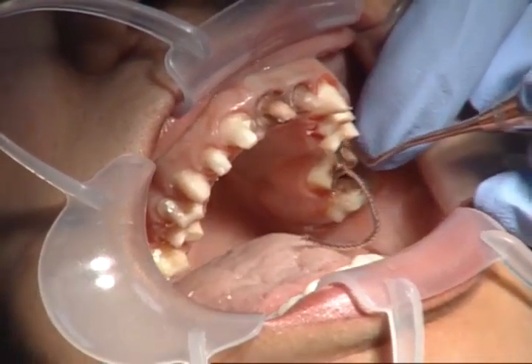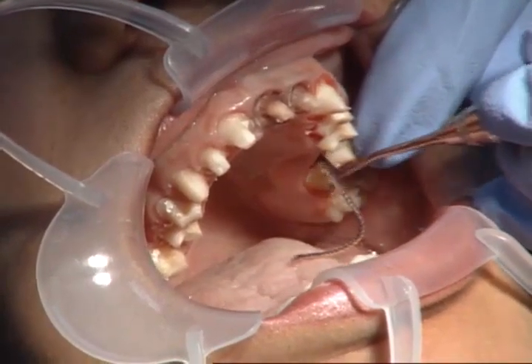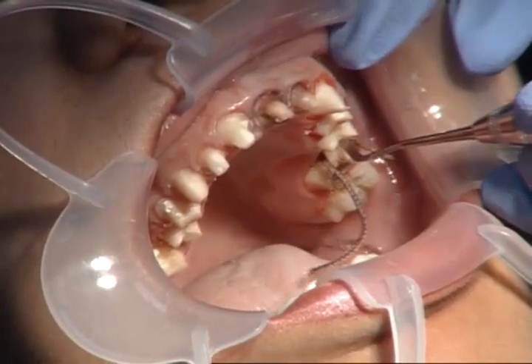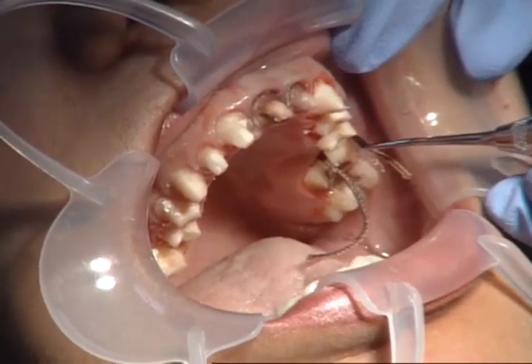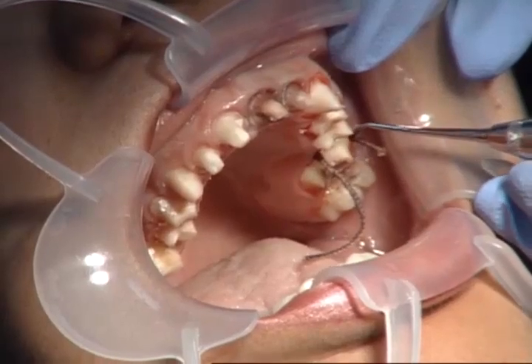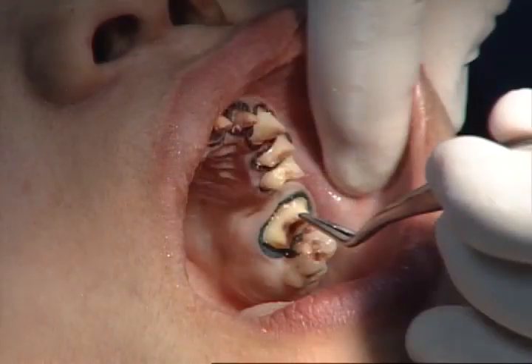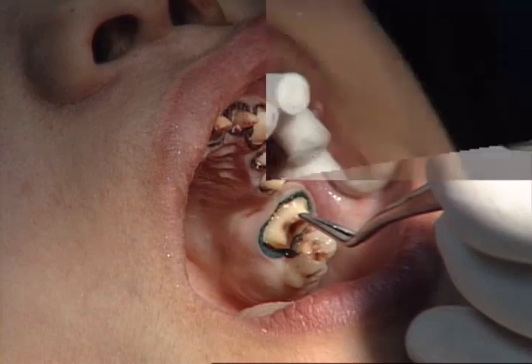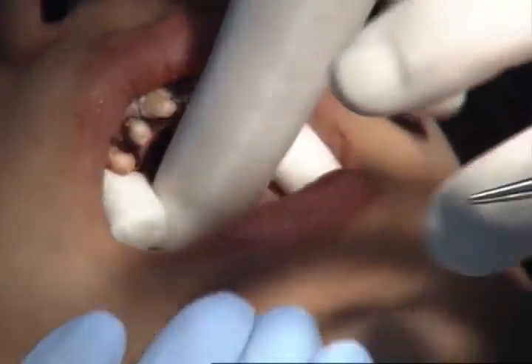But there is more time involved for you and the patient, so your fees may have to go up to reflect that increase in time and the increase in quality, because it really does help you come up with a really nice looking restoration. So the first cord is being placed, a double zero cord from Ultradent around all these teeth, and then we would place the number 2 cord on top of it. These cotton compre caps are put in place as the patient bites down on these.